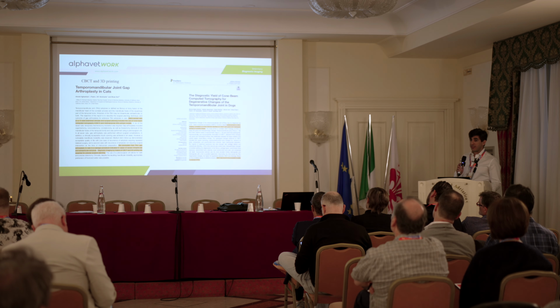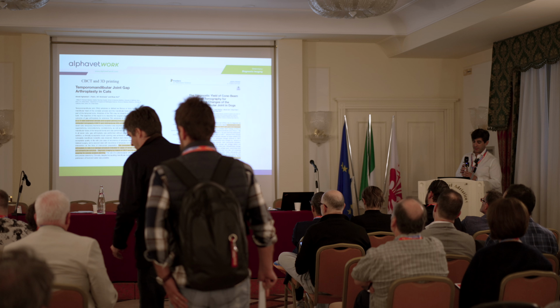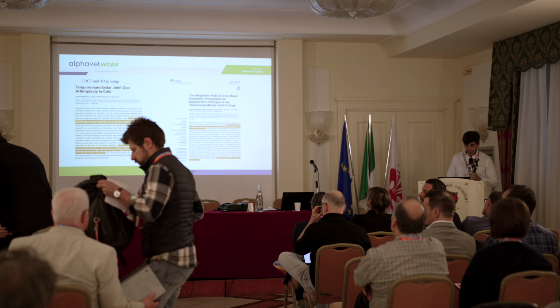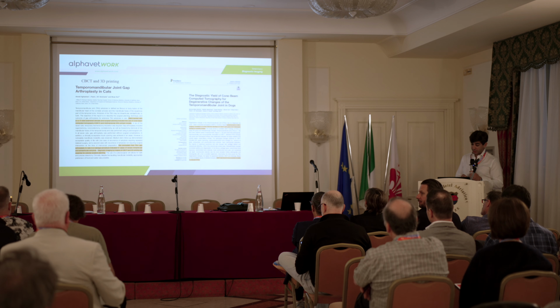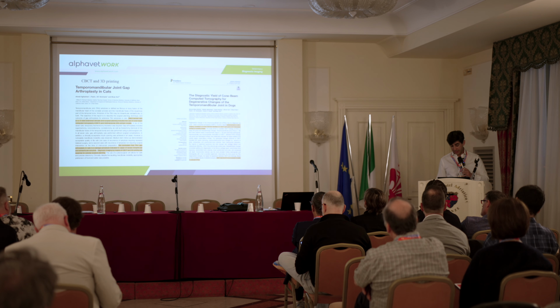The 3D printing is the new fashion that we have, the virtual 3D printing, or the handmade 3D printing that was used for the arthroplasty in cats. They concluded that TMJ gap arthroplasty in cats is a procedure indicated in case of severe intra-articular or extra-articular ankylosis, and in cases of dental issues.